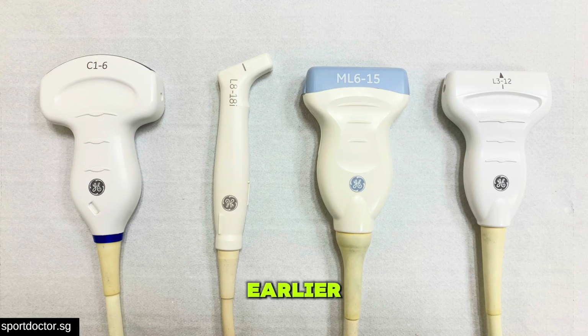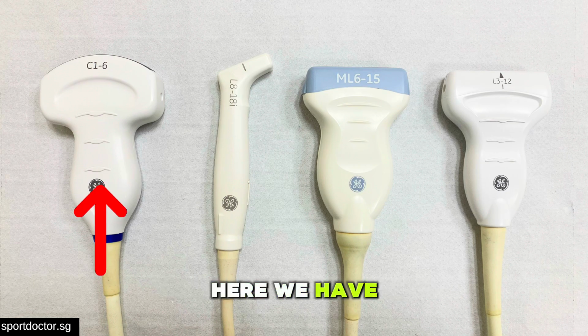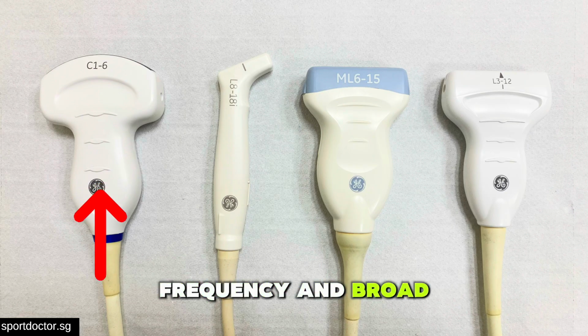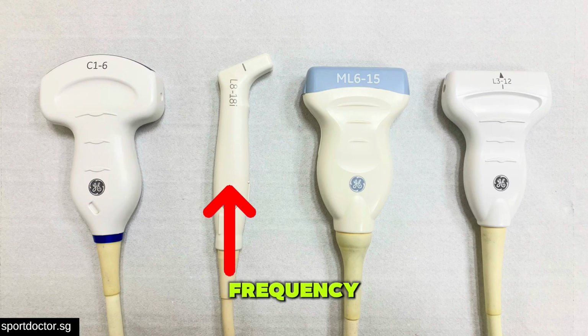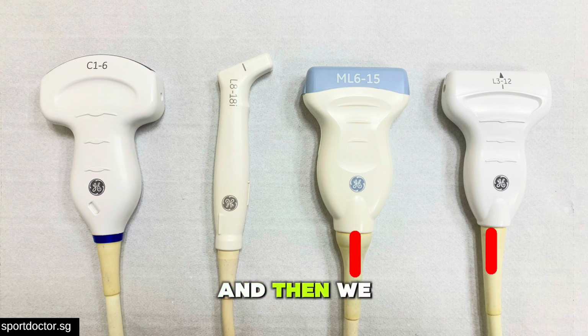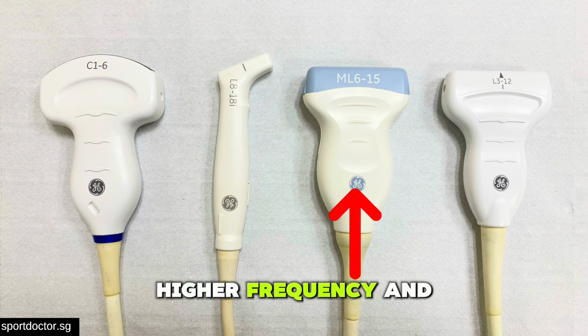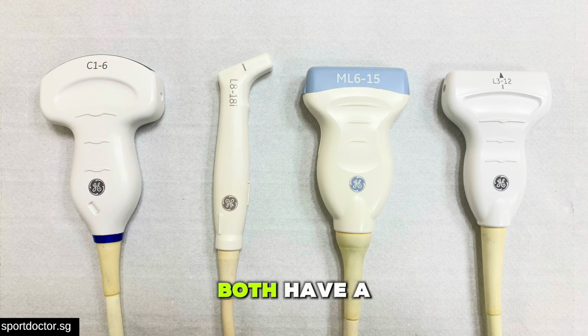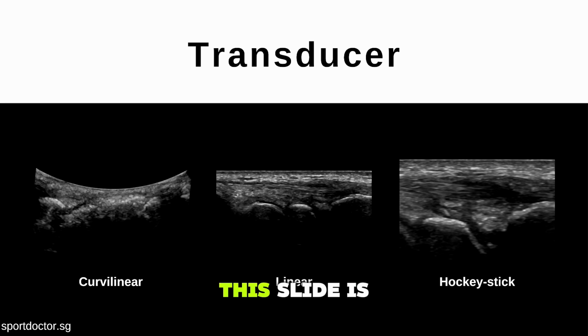As I mentioned earlier, the transducer is an important criteria to select. Here we have the curvilinear transducer with a low frequency and broad field of view. We have the hockey stick transducer with the high frequency and a very narrow field of view. And then we have two examples of linear transducers, one which is higher frequency and one which is lower frequency. Both have a similar footprint, but because of the difference in frequency, the penetration and resolution of each will be different. This slide is just to highlight the importance of selecting the correct transducer.